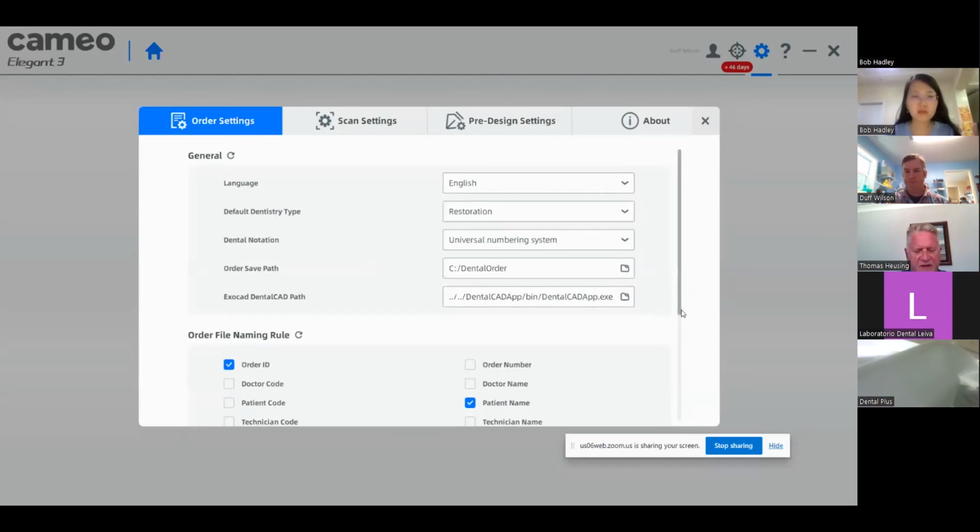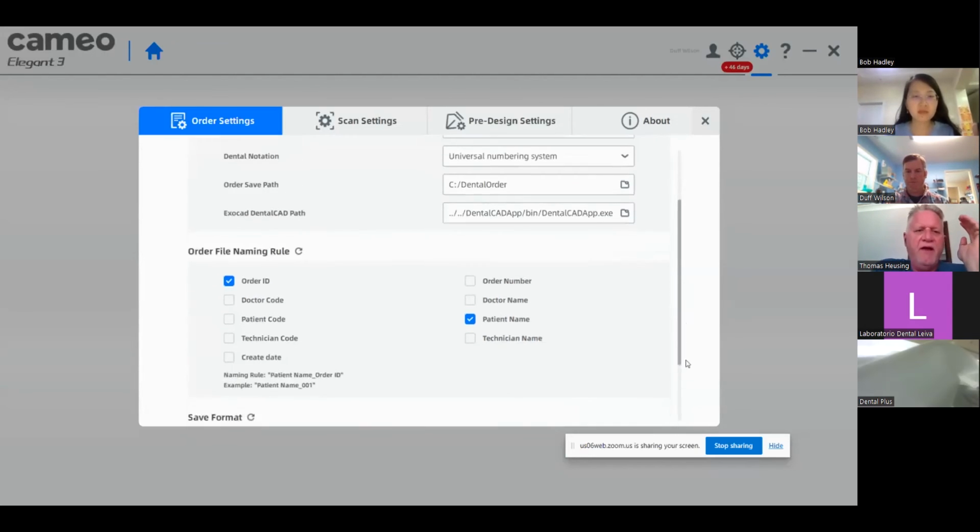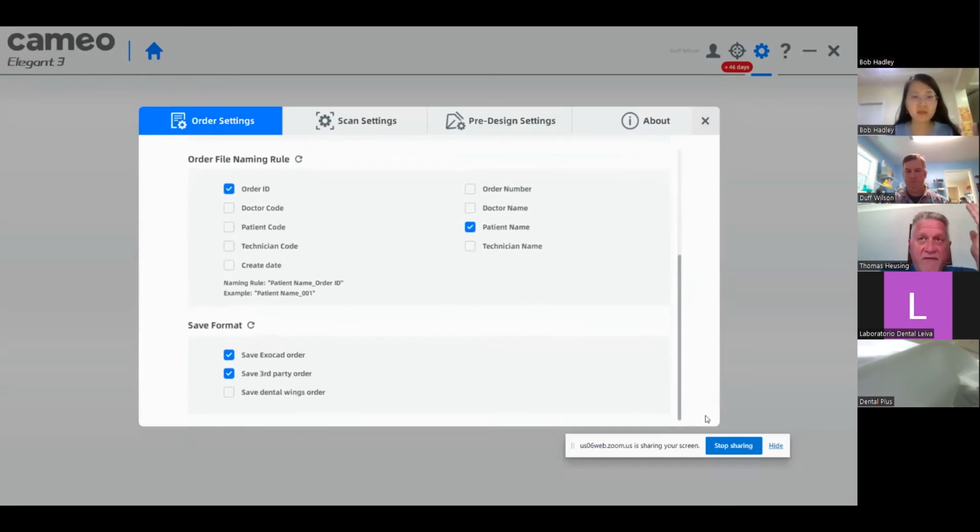And I believe another question that everyone will have is, you've actually gotten your accounts, you're all digital now, and you've gotten your accounts to your doctors to purchase these units from you or from 8ite. How did you go about that with the doctors to get them on board and purchase them?